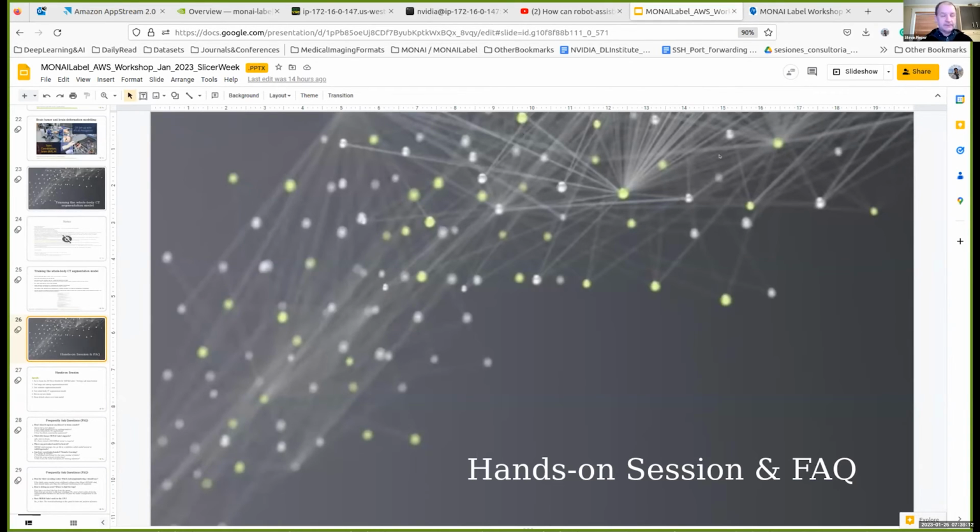Yeah, I think this is great, and I really appreciate the context here. We have these really incredible clinical use cases, and then the step-by-step instructions on how to recreate them. I know it's a bit of a leap to go from one to the other for everybody, but hopefully the hands-on session helps. I know Ching has helped a lot of people get their workstations set up.